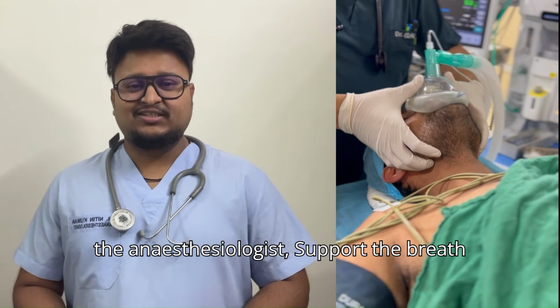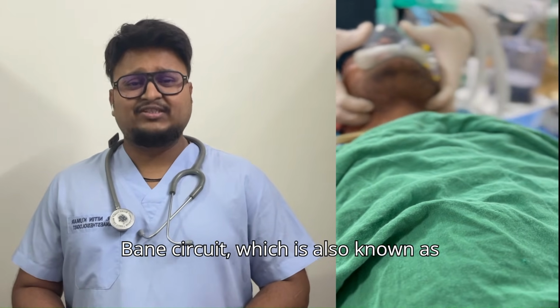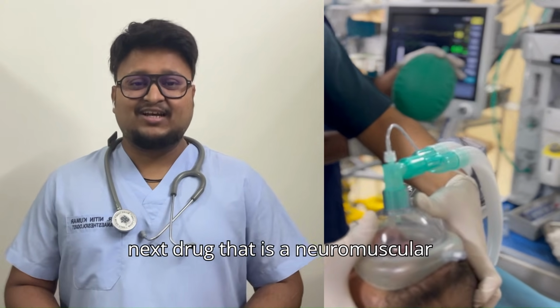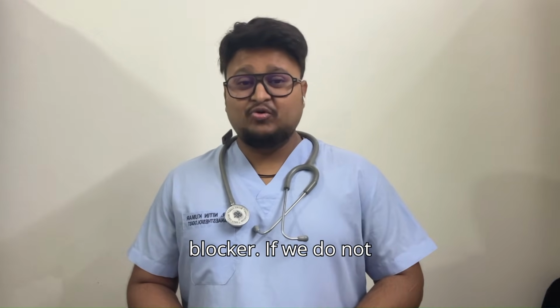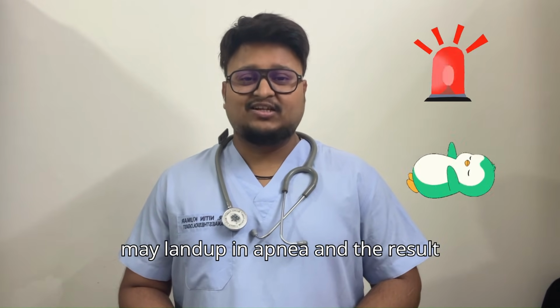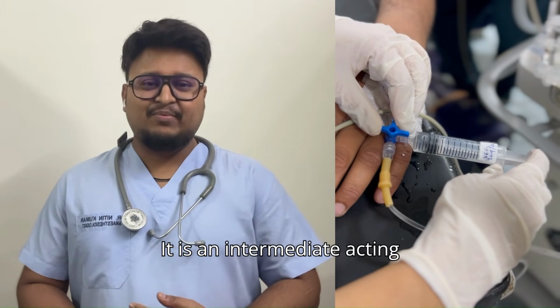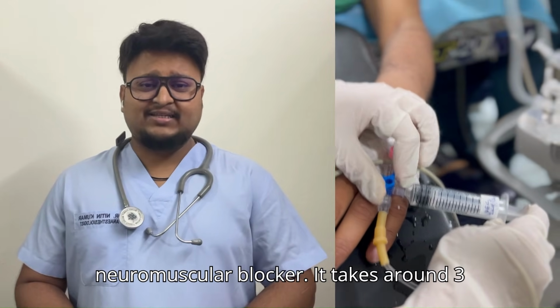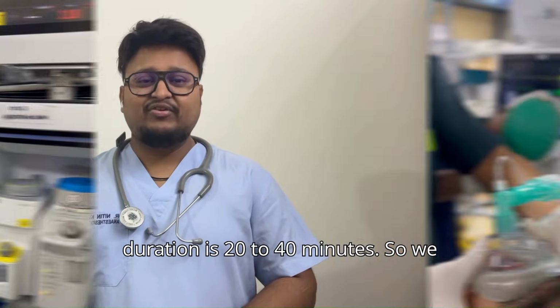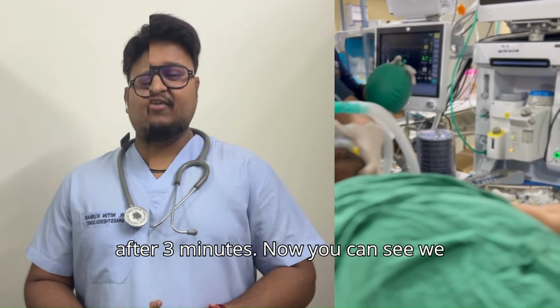Now the anesthesiologist supports the breath with the help of a Bag and mask or Bain circuit, which is also known as check ventilation, so that we can give our next drug, that is a neuromuscular blocker. If we do not check ventilate, the patient may land up in apnea and the result could be disastrous. The neuromuscular blocker we are using here is vecuronium. It is an intermediate acting neuromuscular blocker. It takes around 3 minutes for its onset of action and its duration is 20 to 40 minutes. So we ventilate the patient till 3 minutes and we take the intubation attempt after 3 minutes.